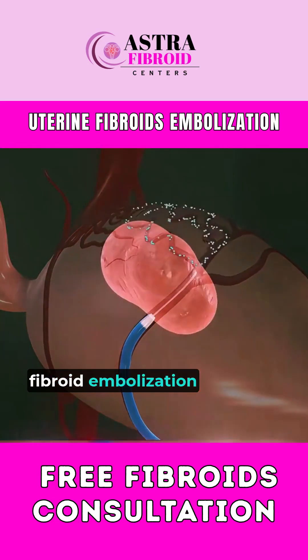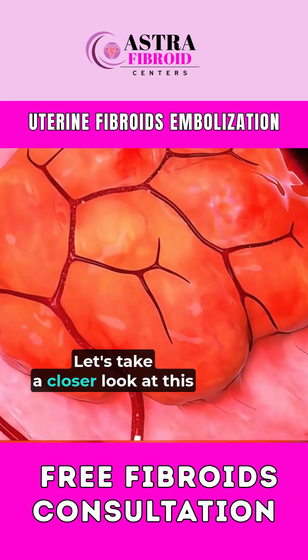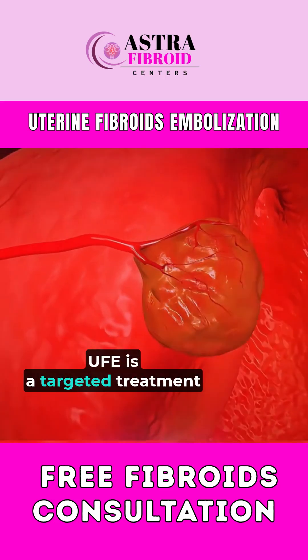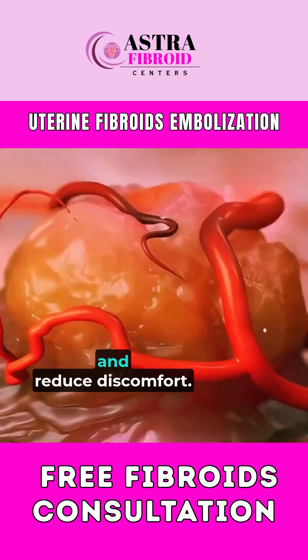Ever wondered how uterine fibroid embolization is performed? Let's take a closer look at this minimally invasive procedure. UFE is a targeted treatment designed to shrink fibroids and reduce discomfort.